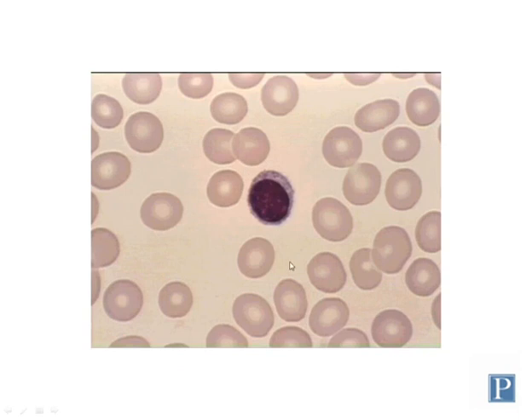Here's another example of a lymphocyte. Again, you can see the nucleus here and a thin rim of cytoplasm. There are B lymphocytes and T lymphocytes. You cannot distinguish those in a blood smear. It requires more advanced histological techniques to distinguish between them. So using a routine stain, they look identical. So don't worry about trying to distinguish between B cells and T cells. You can't do it using this method.